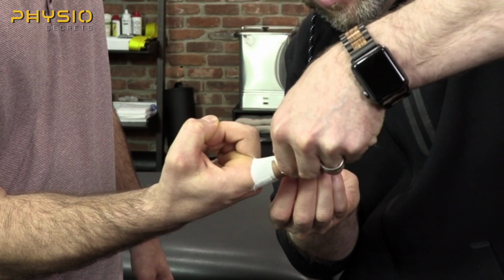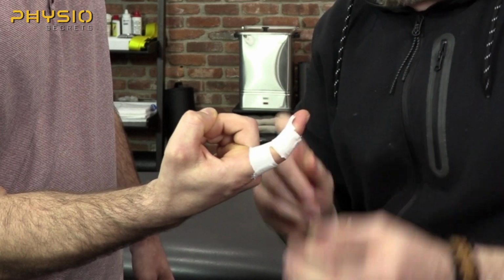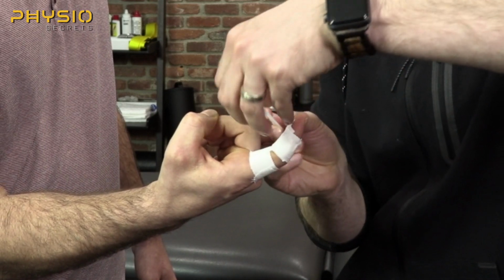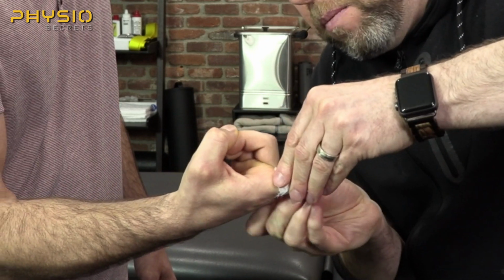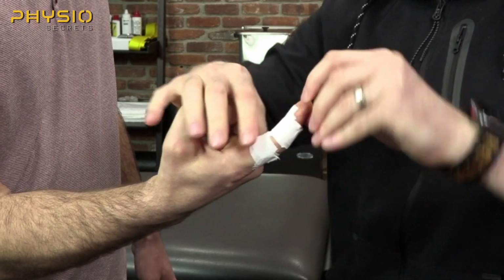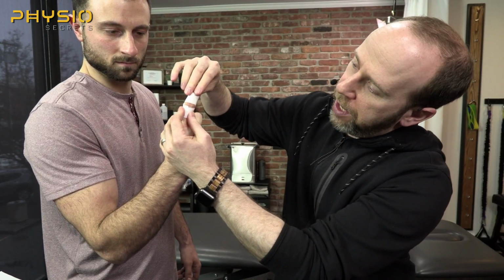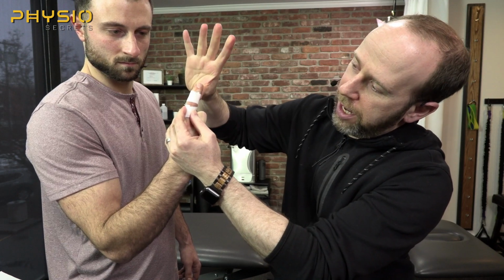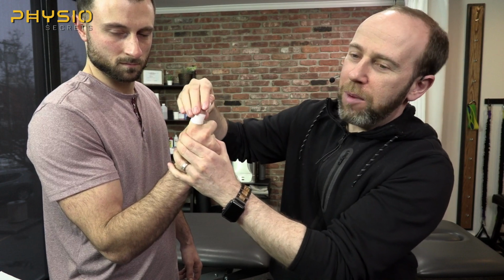And then I'm going to put my anchors on there and then check to make sure his distal phalanx still moves. And I know that his MCP joint still moves. I'm going to put my anchor on there. Boom, boom, boom. And then if I wanted to clean this up, I would just trim the little end point that's there. So you can see that his knuckle is still exposed. His finger flexes, but it does not extend anymore. He's still got motion in his distal phalanx, and he's still got motion in his MCP. So that's the finger tape job.